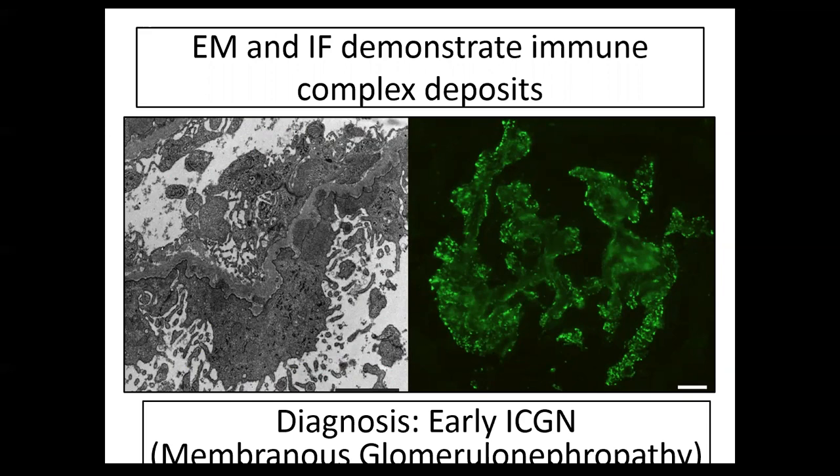So with immunosuppression, do these complexes ever get cleared? We know from human medicine that yes, they can be cleared because we have rebiopsy of patients with periodic bouts of lupus. So they might get cleared and then they get rebiopsied later and they get restaged or reclassified, I guess is what we use for that term, and then they can change from membranous back to mesangial alone. So yes, we know they can get removed.